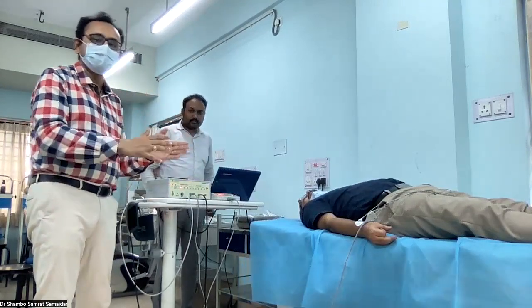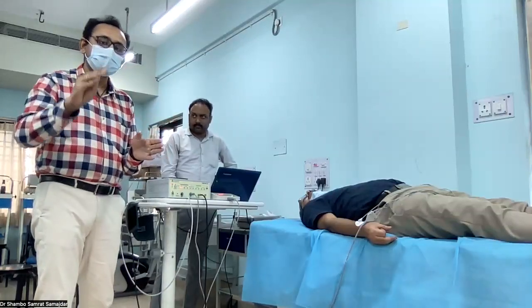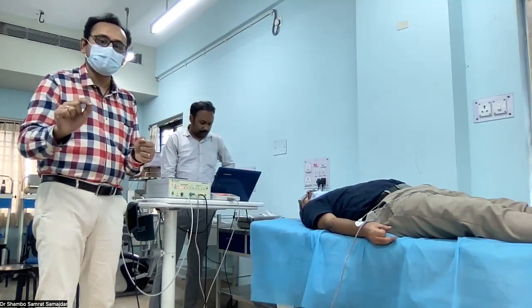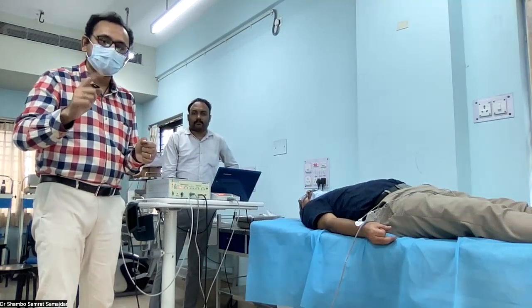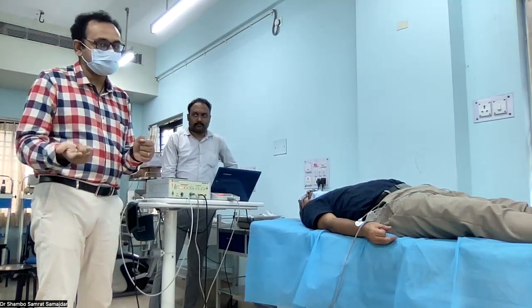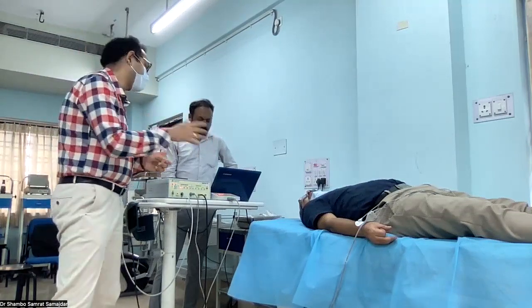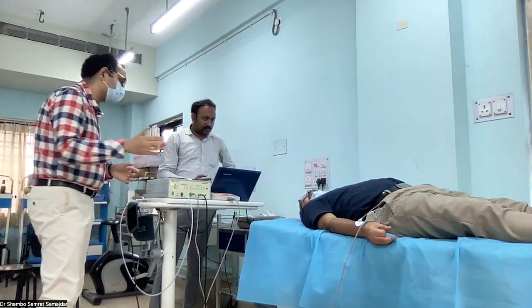We need to repeat that expiration inspiration cycle for 6 times. So 5 second inspiration, 5 seconds expiration, like that. So 10 seconds means 1 cycle. We need to do it for 6 cycles. So that means 60 seconds, 1 minute. So let's start.